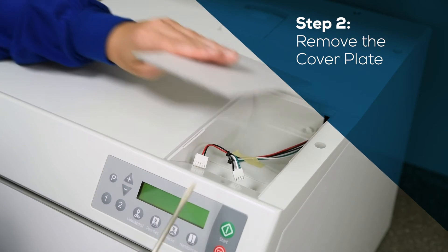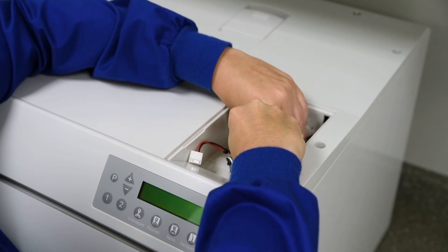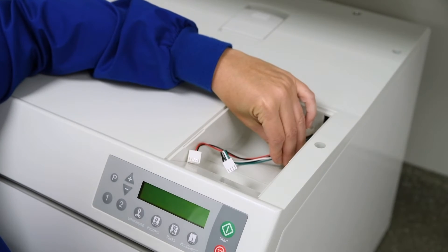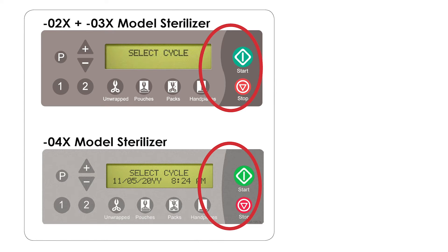Remove the cover plate from the top right of the sterilizer. Then remove any double-sided tape left on the sterilizer. Before completing the following steps, identify the model of the sterilizer where the data logger will be installed.